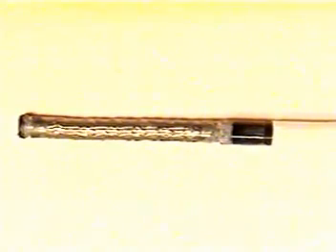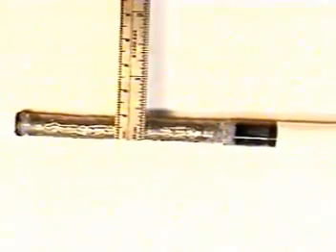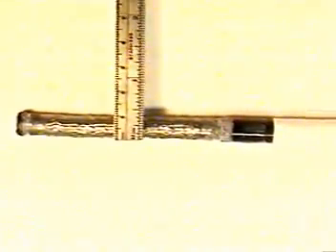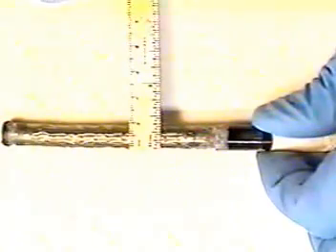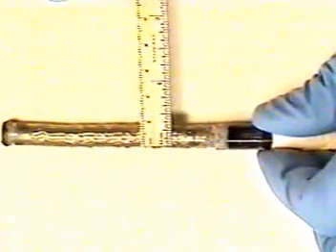This particular scope, an Olympus GIF-XQ20, will require a 9.8 millimeter bending rubber sheath. Using a ruler with millimeter markings, we can measure the endoscope from one side to the other side of the bending section. Again, in this particular endoscope, it is a 9.8 millimeter bending rubber sheath which will be required.